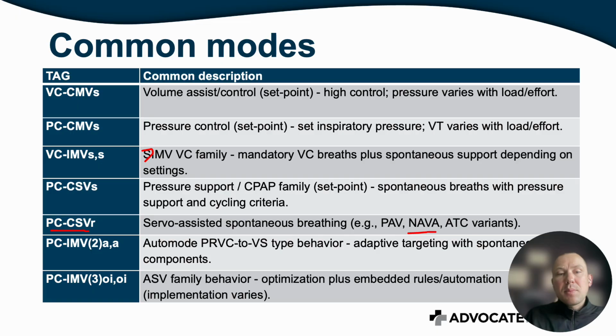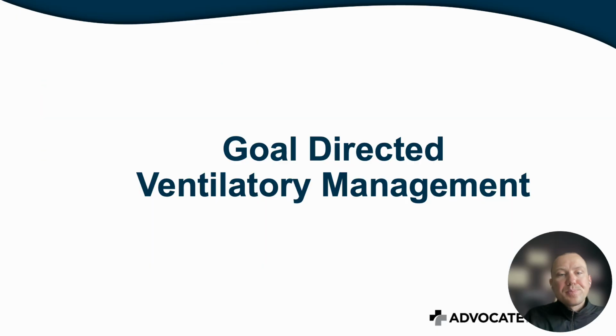One thing I'd like to mention about IMV, or intermittent mandatory ventilation: there are 5 types of IMV, and it can be really challenging to understand which specific type of IMV the patient is on, and reading the manuals of the mechanical ventilator could be extremely helpful to understand that.